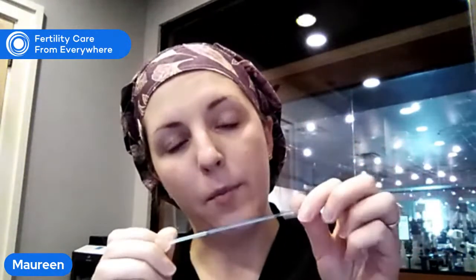That's okay. All right, so when you're doing your embryo transfer, there's a lot of double checks to the ID process. So when we thaw the embryo, we have 2 embryologists checking the cryolock, which again is this little device where the embryos are. So we're comparing the name, date of birth, everything to make sure which embryo we're thawing. We have 2 embryologists doing that. And then at the time of transfer, your embryo transfer dish, which is where your embryo is living for a few hours, has your name on it, and then your incubator spot has your name, date of birth, your partner's name, date of birth, your unique ID.